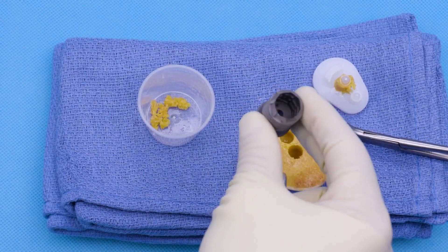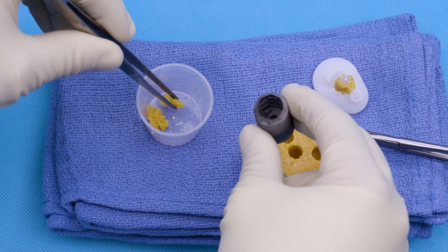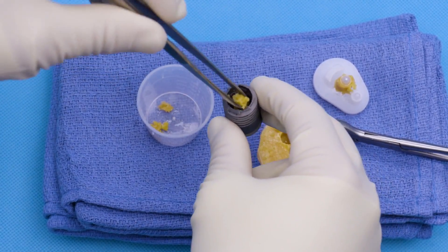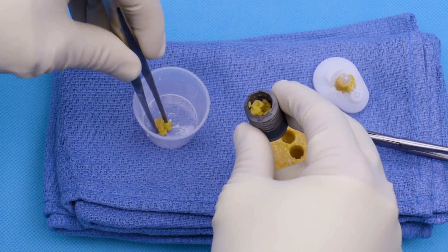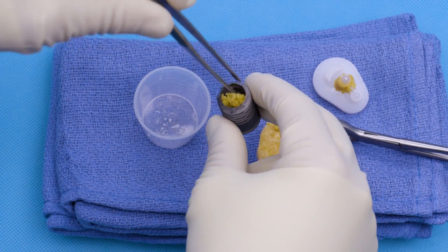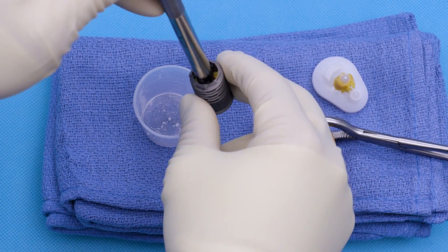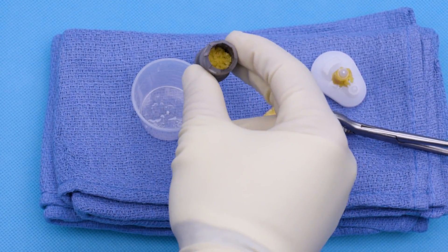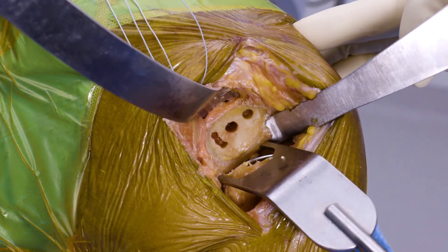Our next step is to bone graft our cage screw for our Eclipse. We take our morselized graft from our OsteoAugr and we can pack this into our cage screw. And if need be, we go ahead and take a bone tamp and squeeze it down. We're going to cement the top and the bottom and then we're ready to go ahead and implant.